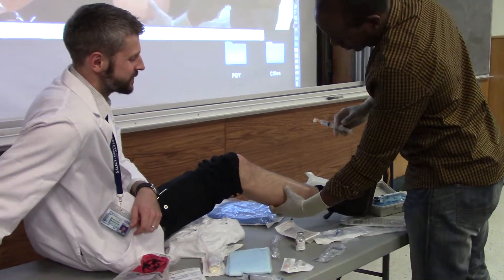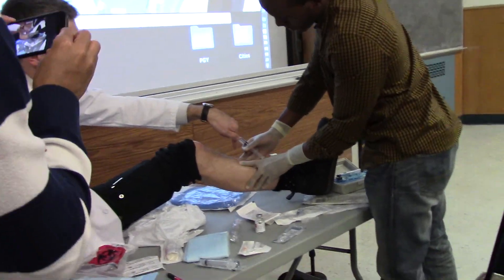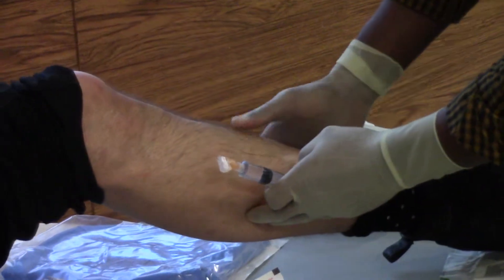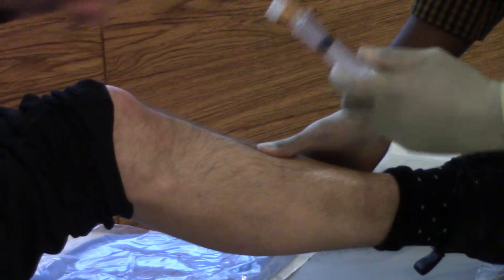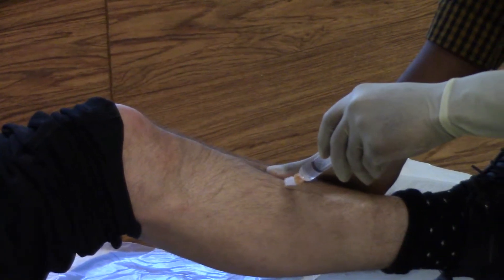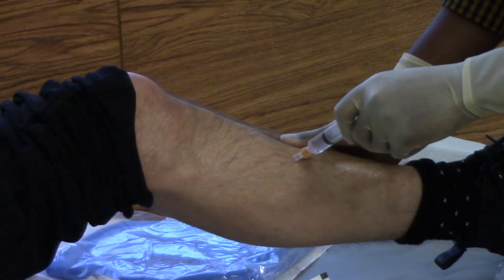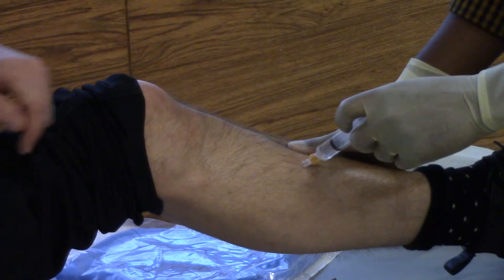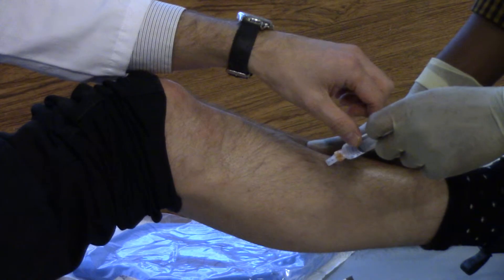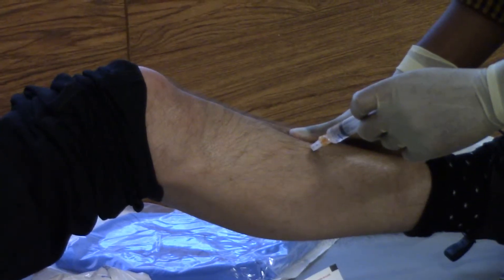So we're going to practice here. We're going about a few centimeters, and I know about one finger width. It's going to burn a little bit. The person who ejects all the time — yeah, a little bit more, you don't have to fish that much. So we're not putting too much in; it's not so deep.